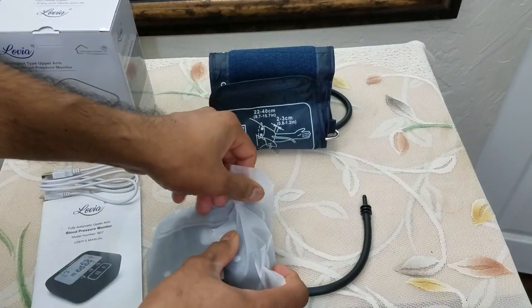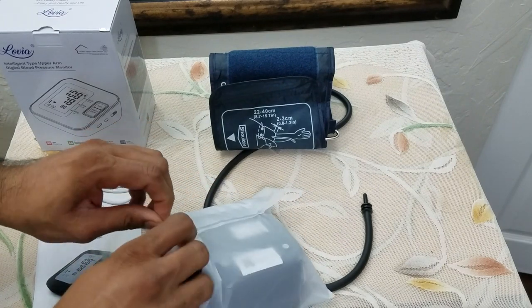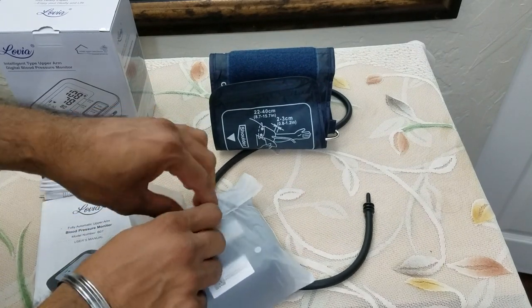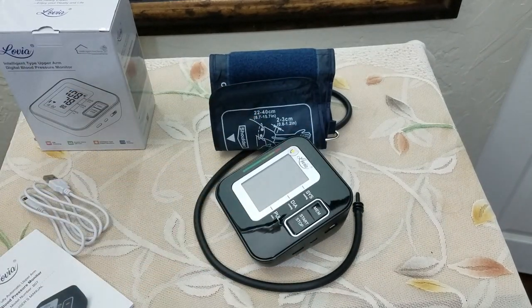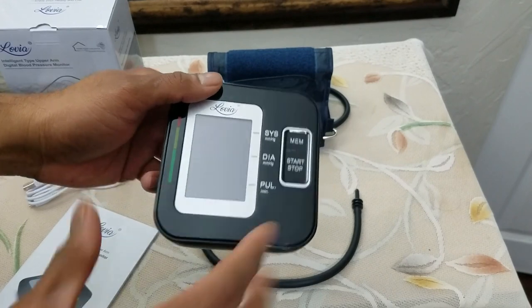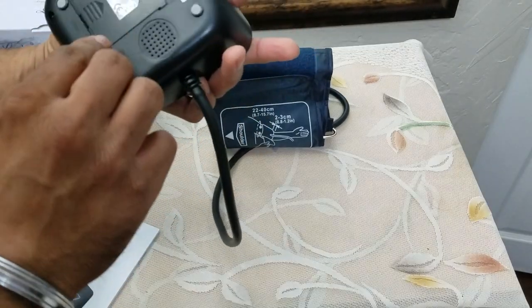Now for the main unit — extremely nice plastic. I will say this plastic is extremely soft; it is not one of those shiny plastics. Really nicely packaged, as you can see, and the tube will go this side and plugs in here. It has a USB connection.